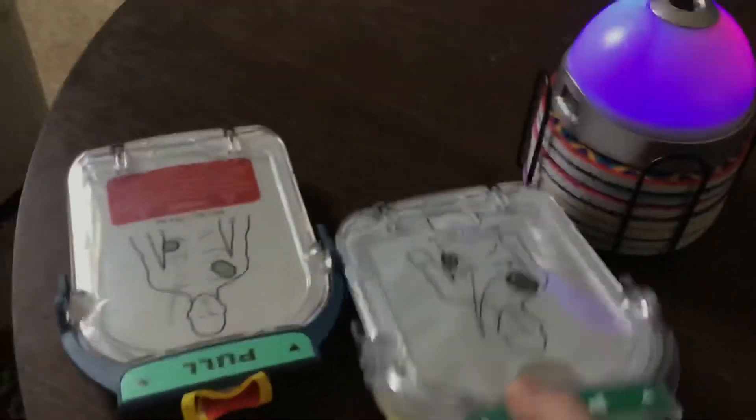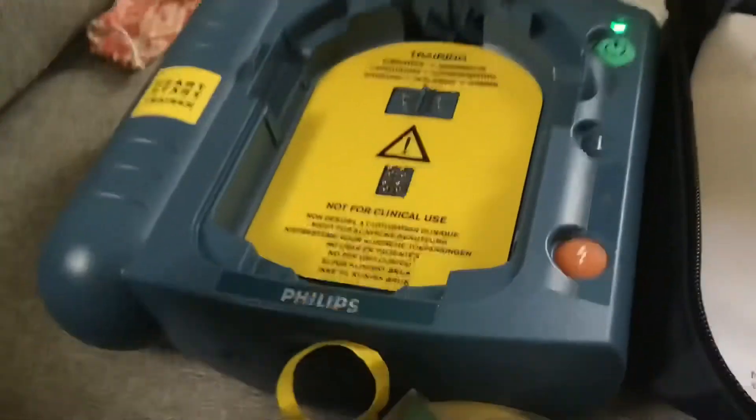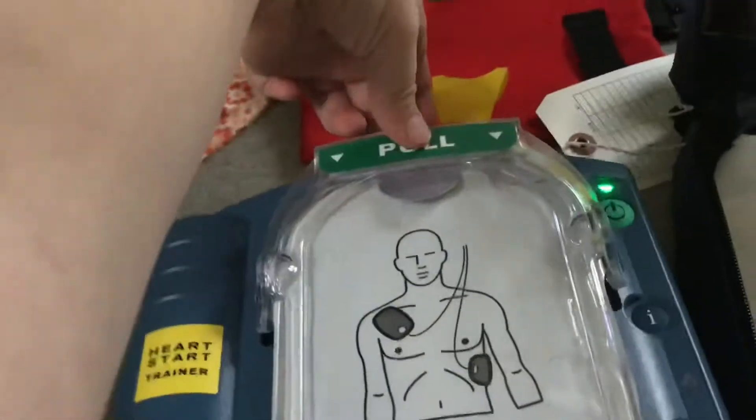They popped and come right out. These are going to look different because these are training pads and this is a training pack. Be careful — they might hurt because they're spiky. Take your pads, put the bottom in first, and then push in the top.